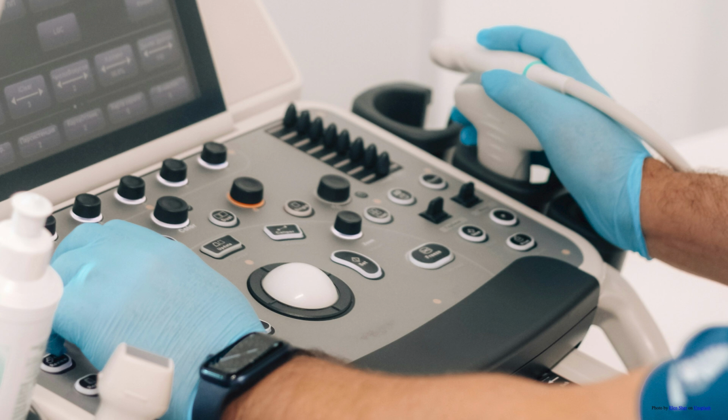And if you think historically, it's something we discovered in the emergency department. Because we're doing so much of this, and because we're looking for a few simple things, maybe this is something that we in the ED can take the first crack at, doing the screening test to see if there is evidence of cholelithiasis or cholecystitis that would either prompt us to get a surgeon on board now, or to do further imaging. If something looks funny, I need to work this up a little more and see what else is going on. Now, because I've done my screening test, I can be more focused with my follow-on imaging tests, as opposed to shotgunning if I don't have that prior knowledge from my ultrasound. So that's where we're going.